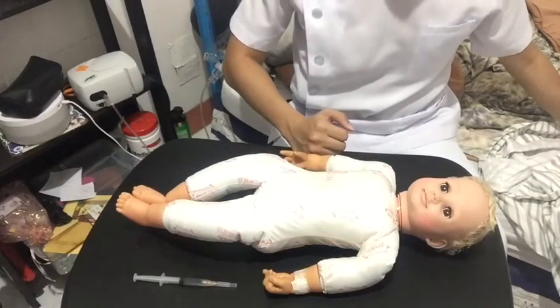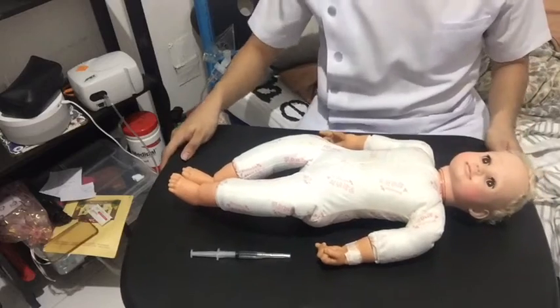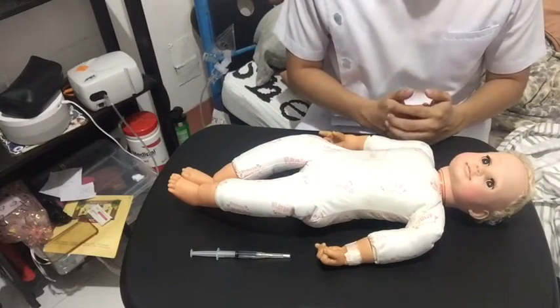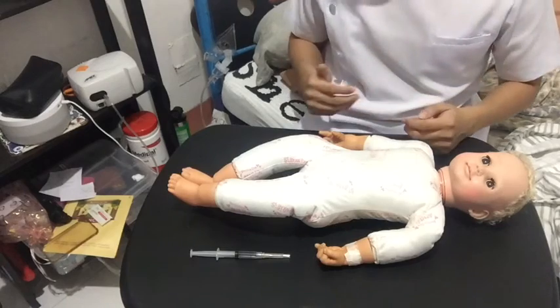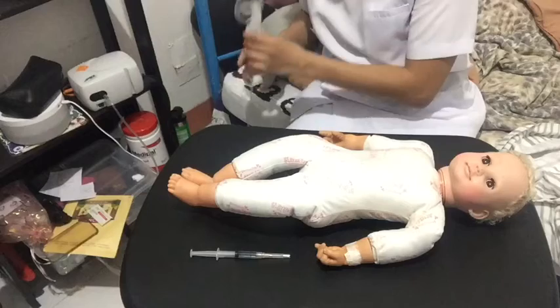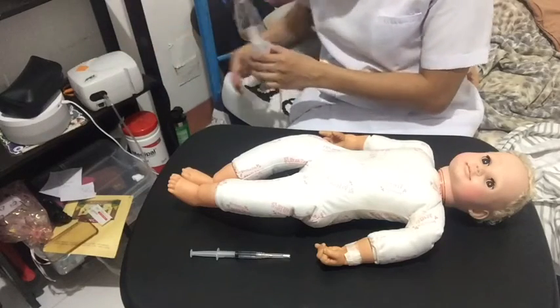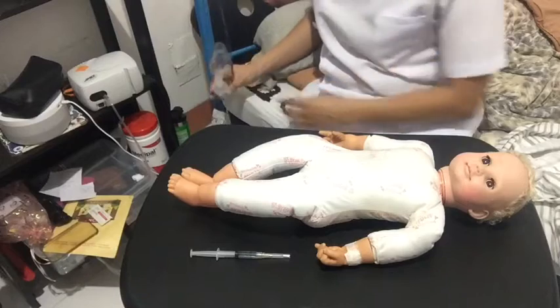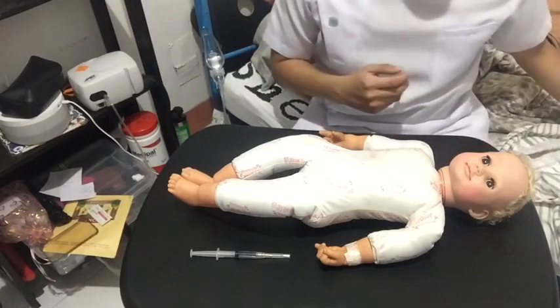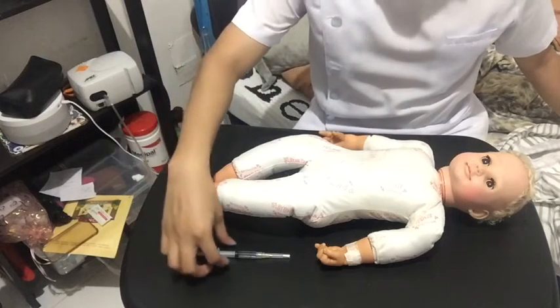Now, after teaching the client the proper way of nebulization, we're going to be assembling the nebulizer equipment needed. So this is what I got. I already assembled it, and here's the nebulizer machine and the nebulizer kit. So after assembling the nebulizer equipment, we're going to be using a prescribed medication.